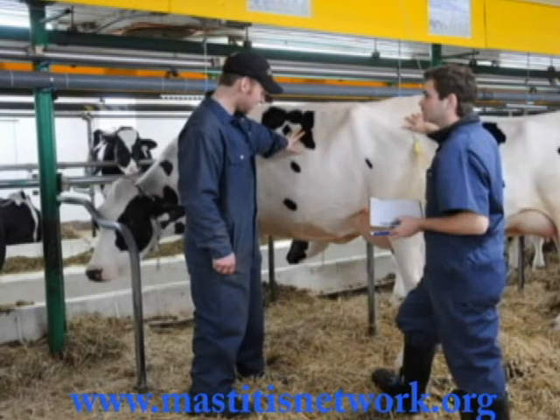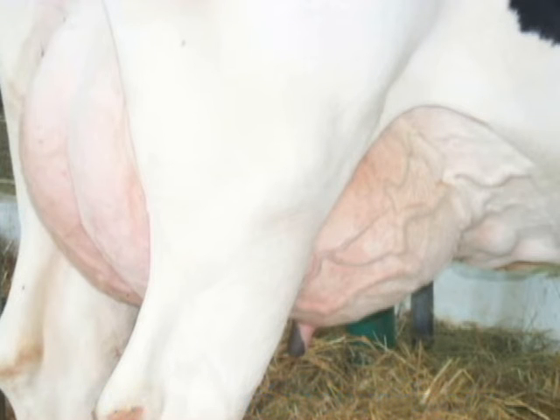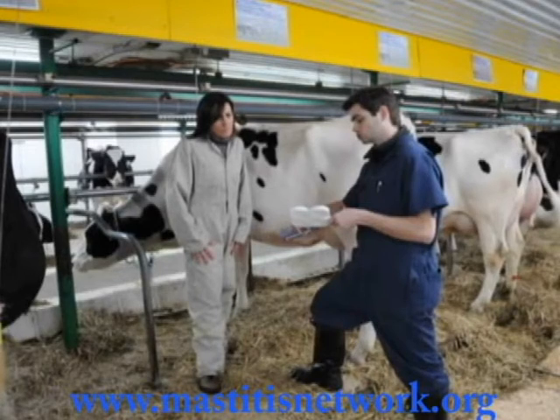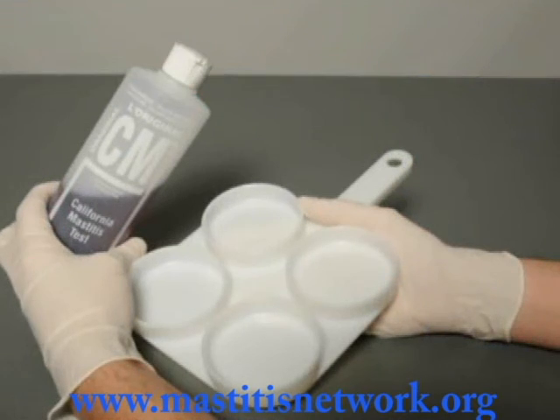The CMT may be used in different situations. First, to verify the health status of a cow you wish to purchase. Second, to identify specific quarters for further testing and possible treatment when a cow has a high somatic cell count. Finally, to detect the presence of subclinical infections at the beginning of or during lactation as part of an udder health management program. For more information, please consult your veterinarian. Simple, quick and low cost, the CMT is worth including in your dairying routine.